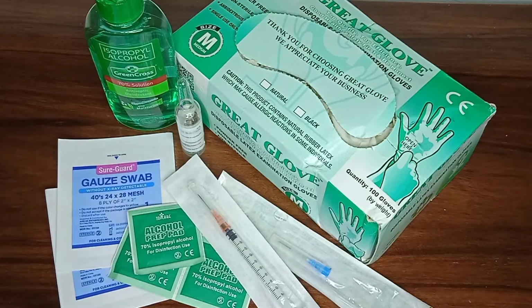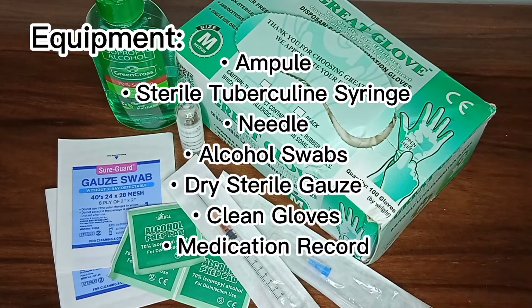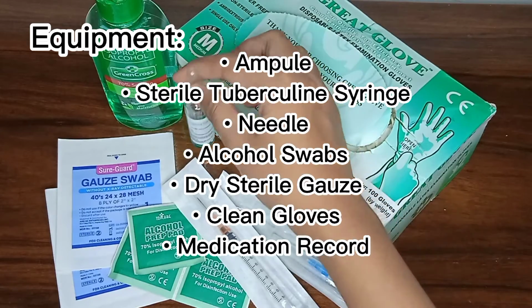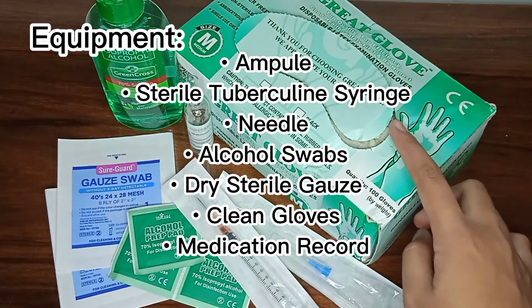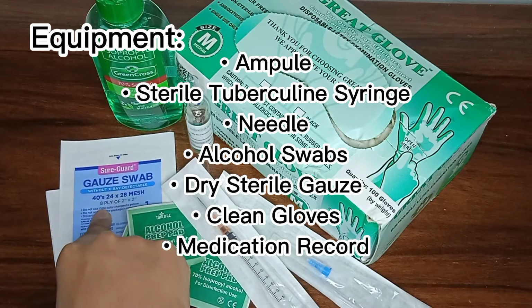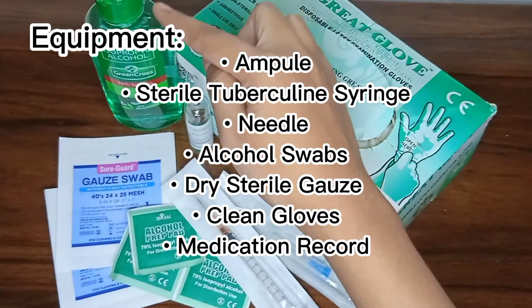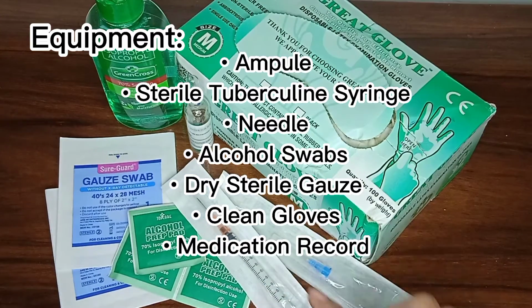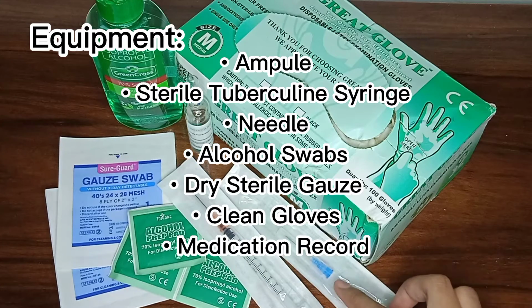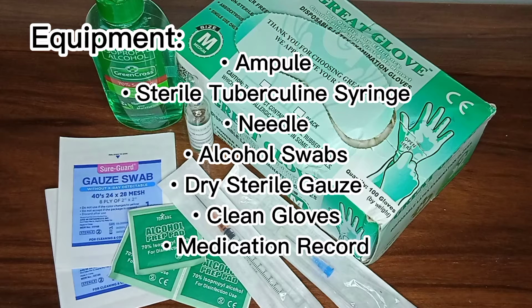The next thing that I'll be showing you is how to administer a subcutaneous injection. In administering a subcutaneous injection, the equipment we'll be using are the following: an ampule, this should be the correct sterile medication. Of course, clean gloves, alcohol prep pad, sterile gauze, dry sterile gauze, alcohol for sanitizing, sterile tuberculin syringe with needle, and another extra needle. And of course, the medication administration record of the patient.